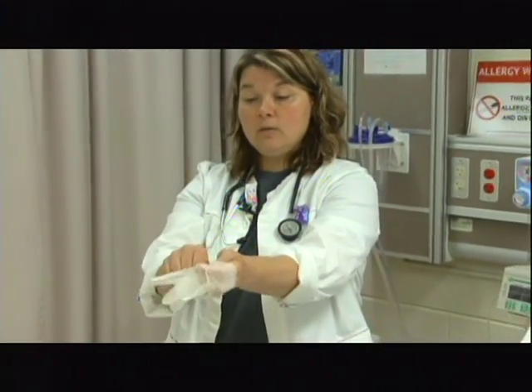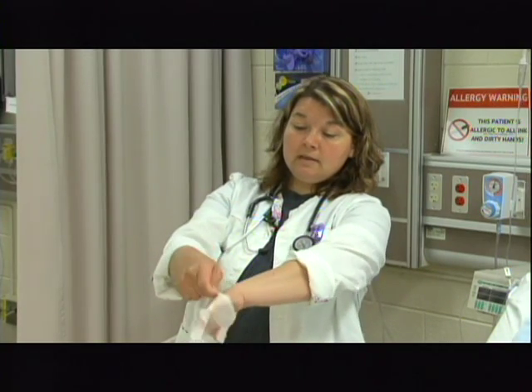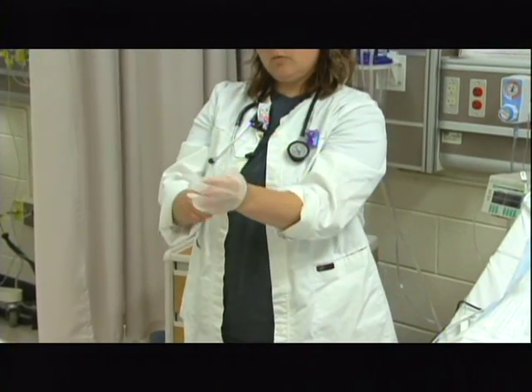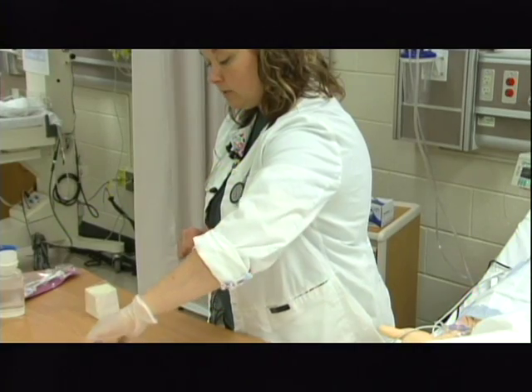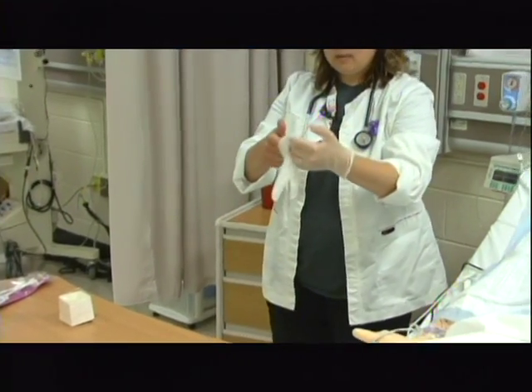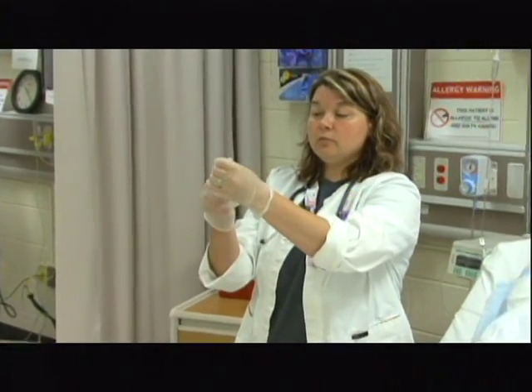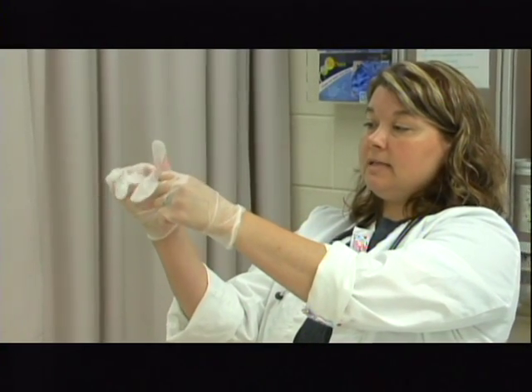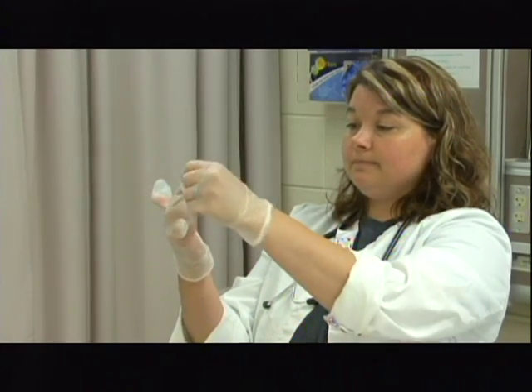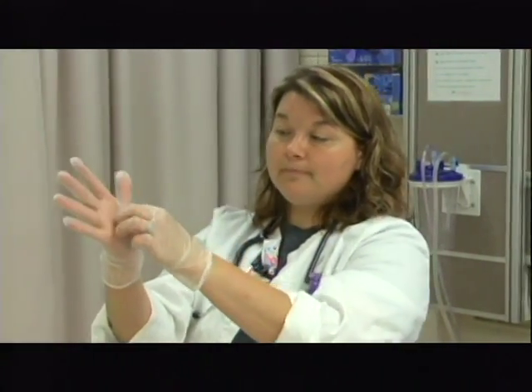I've grabbed the inside cuff and moved back away. I'm going to go ahead and put my gloves on. As I put these on, as long as the only thing I'm touching is the inside of the cuff, I'm okay. Now this hand is considered sterile. I still want to go underneath the cuff of the other glove — I lift up, pull back away, then attempt to put the glove on. I ended up grabbing it and the glove went on differently, but since this hand is sterile, I can maneuver and flip the glove around without contaminating it, putting all my fingers in. My gloves are now on and sterile. I need to keep them above my waist or at waist height.